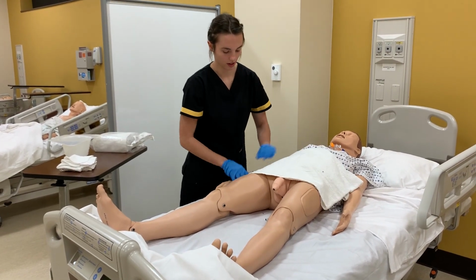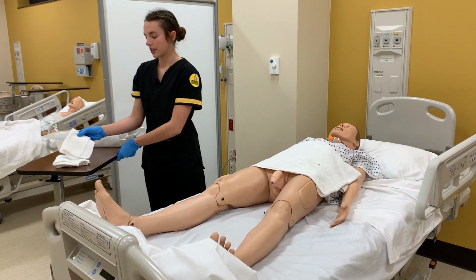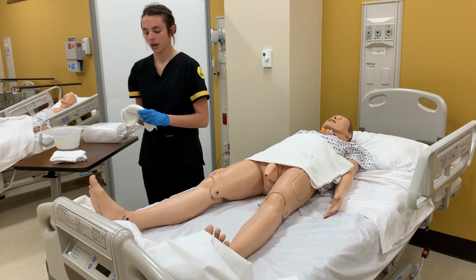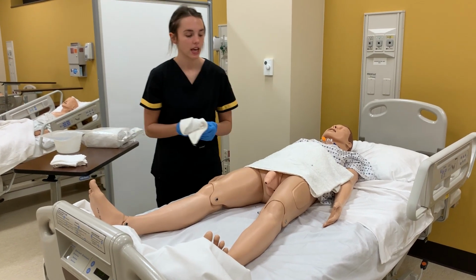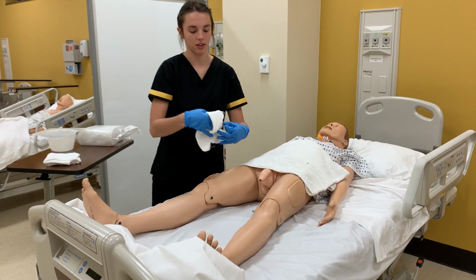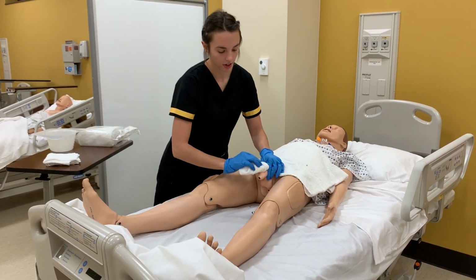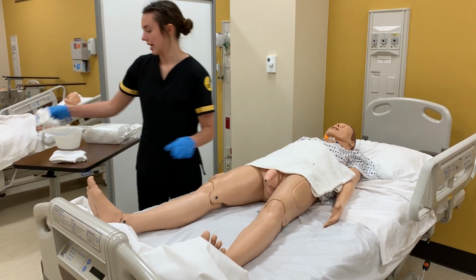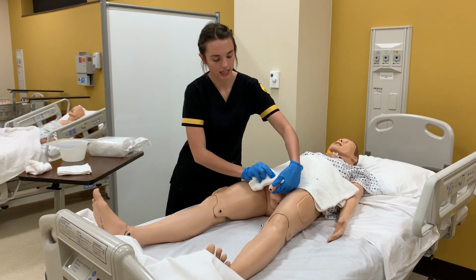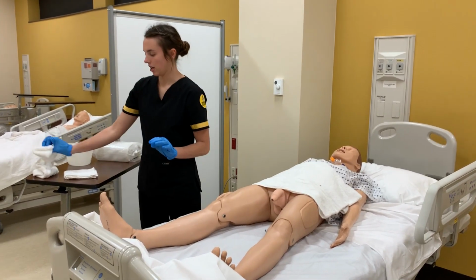Okay, there we go. So first, before we begin, I'm just going to do a normal perineal cleaning. So I would have just some warm water and a clean rag, and I would just clean around once, and then get a new section, clean rag, water, clean around, get a new rag, water, and then clean downward strokes. And that would be good.